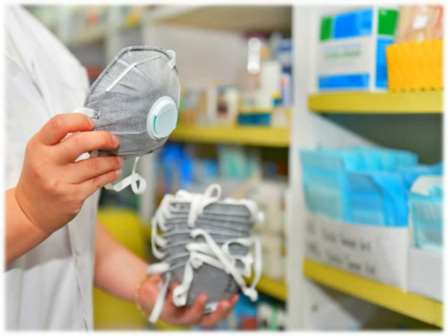Please remember to avoid touching the outside of the respirator as this could contaminate you. If you inadvertently touch the outside, remove your gloves and wash your hands for the full 20 seconds before applying new gloves. Regardless of the setting, the number of times a respirator is used should be limited. The National Institute of Occupational Safety and Health reports there is no way of determining the maximum possible number of safe respirator reuses.